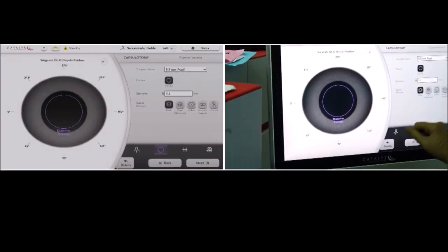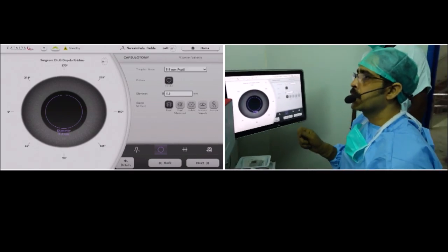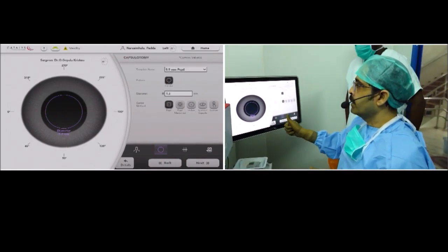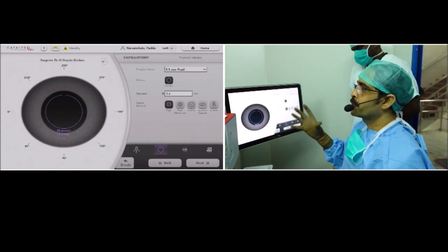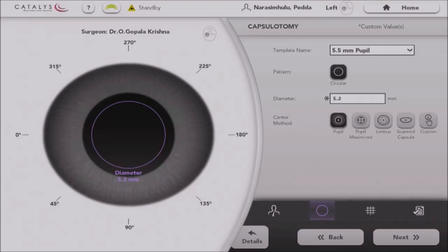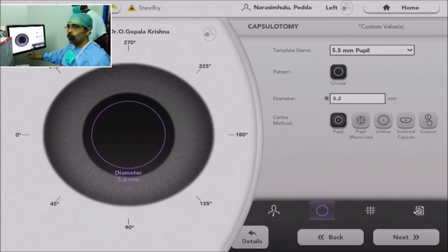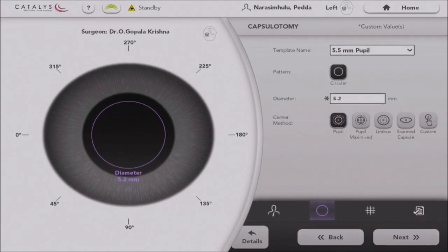The next step is capsulotomy. The advantage of capsulotomy with femto laser assistance is that the size of the capsulotomy can be titrated, and the shape of the capsulotomy is perfectly circular. There are studies saying the circularity of the capsulotomy will help you get better centration in case of premium IOLs like toric, multifocal, and symphony IOLs. The size and centering of the capsulotomy can be titrated as required.